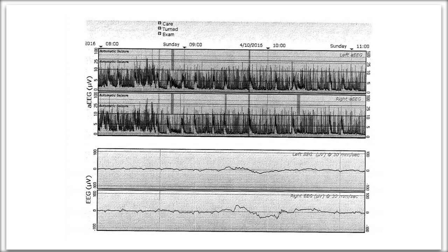It's hard to say. The other thing I'm noticing is that the EEG is set for plus or minus 100. When the voltages are so low, I would recommend that you toggle this EEG to plus or minus 50 so that you can tune in better to the spike waves if they're happening in any of these areas. You can't adjust the aEEG on this particular device, but you can adjust the EEG scale. For a baby who has such a low background pattern, I would recommend that you definitely get this scaled in. And based on the background voltages alone, and the history, a full EEG is warranted.